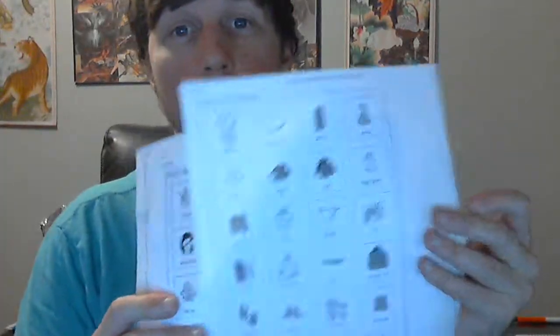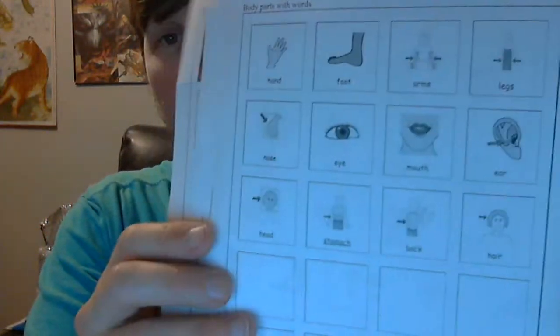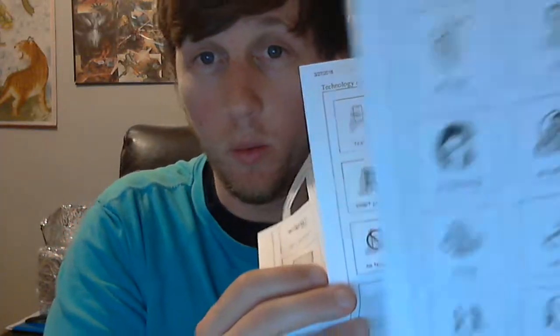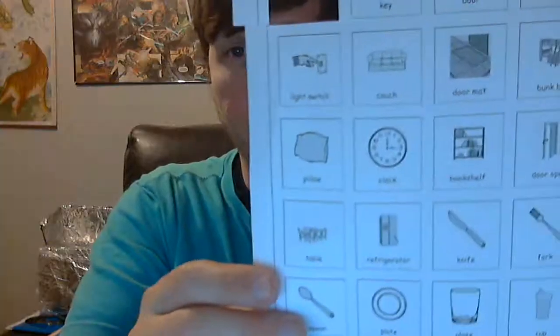So I've got tons of picture cards, or PECs, that you can customize each wheel with, each sentence with.